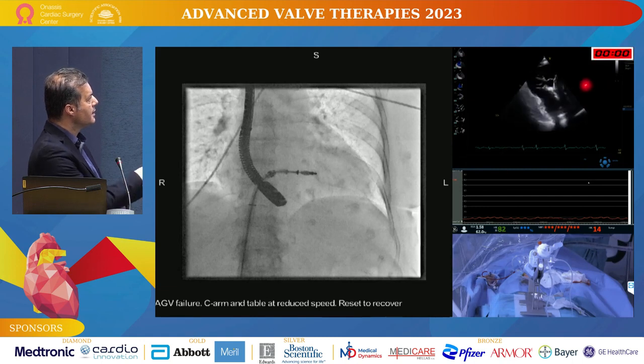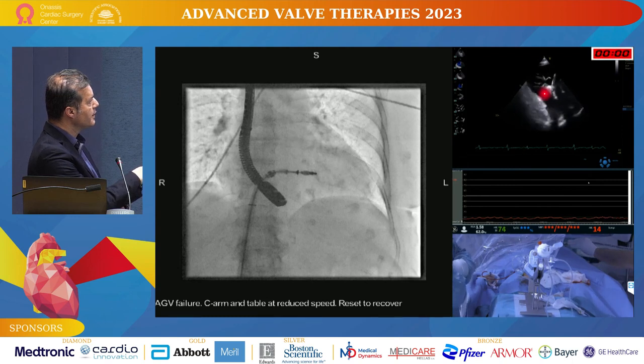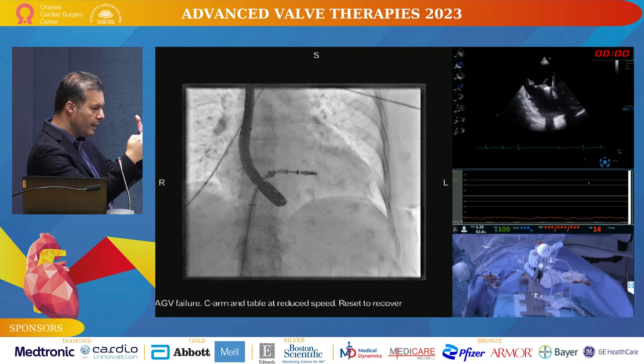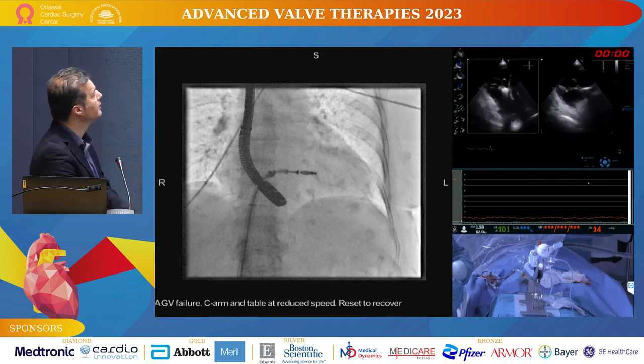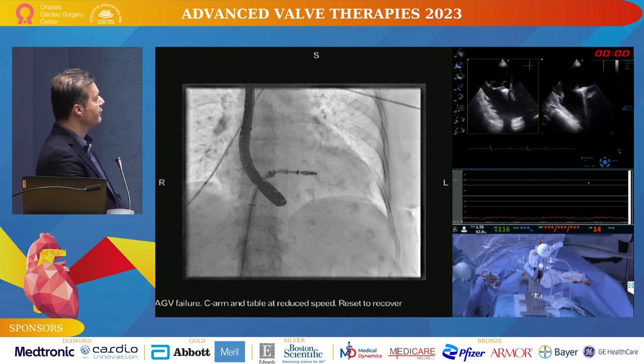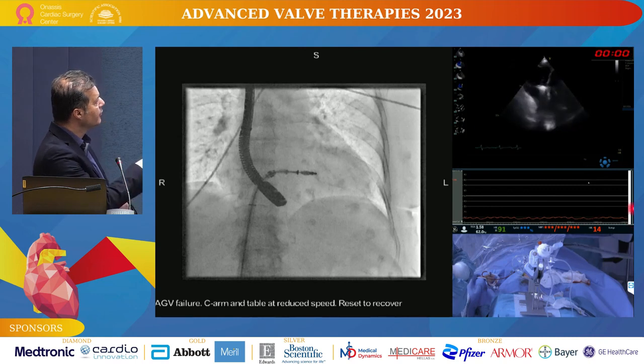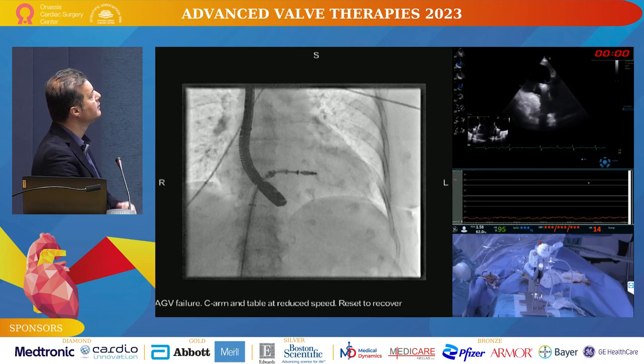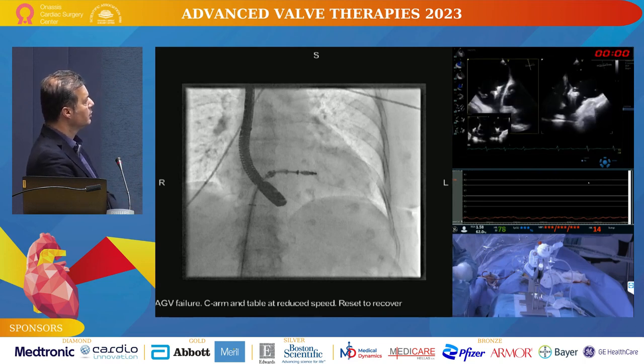So that's a useful view to see how the leaflets are being inserted into the clip. So the anterior leaflet and the septal leaflet are creating angulation and they're falling into the clip. So that's a good sign that we have enough grasping. And of course, we're left with the central part of the valve now, open. We will see in a minute.